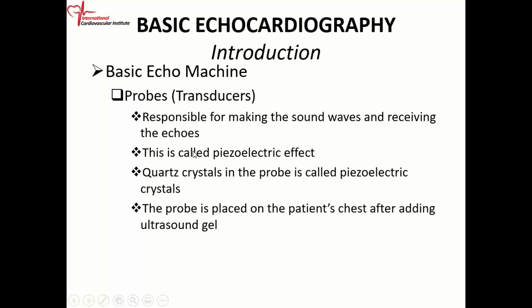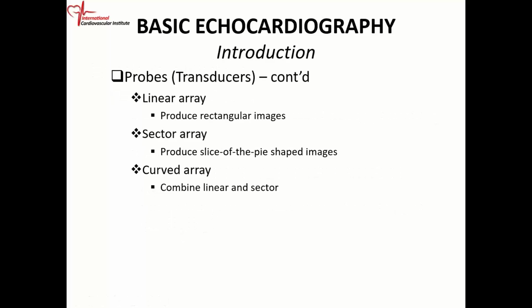The probe has some crystals, we call them piezoelectric crystals. When you plug the machine in and you plug the probe in, these piezoelectric crystals vibrate to create the sound wave, and that's what we call the piezoelectric effect. So they create the sound wave and they send the sound wave into the patient's chest, okay? And then they're reflected back to the probe and you see images. So it's a straightforward thing.